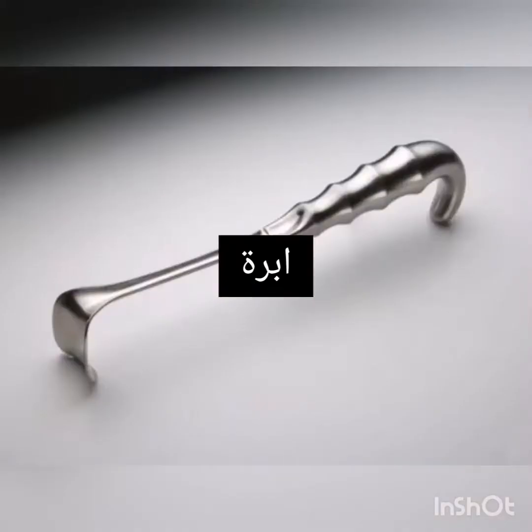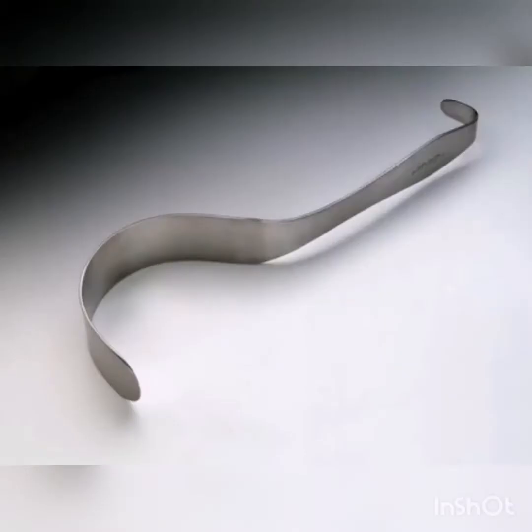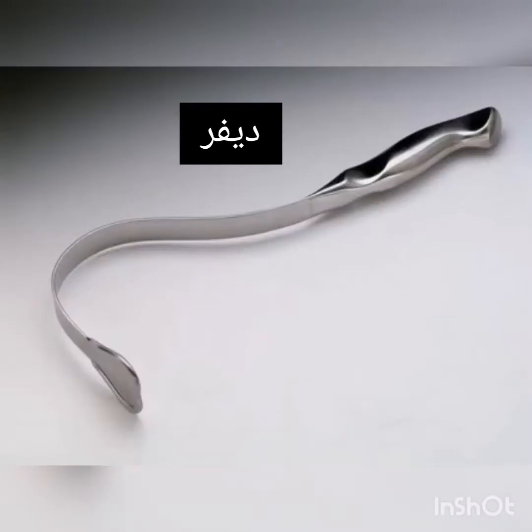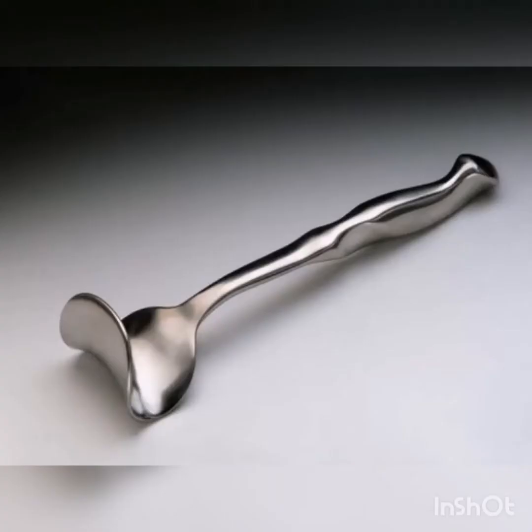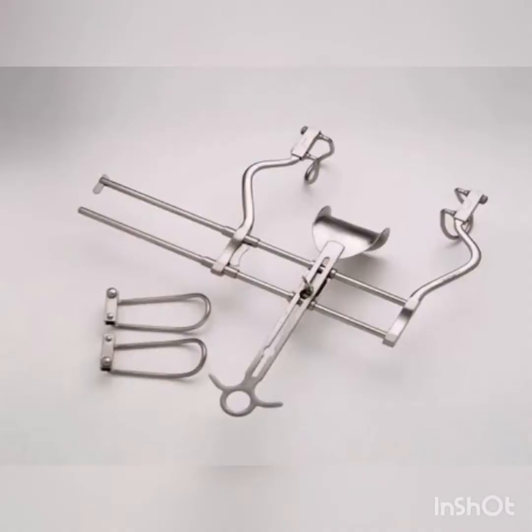Richardson Retractor. Deaver Retractor. Harrington Retractor. Mayo Abdominal Retractor. Balfour Retractor.